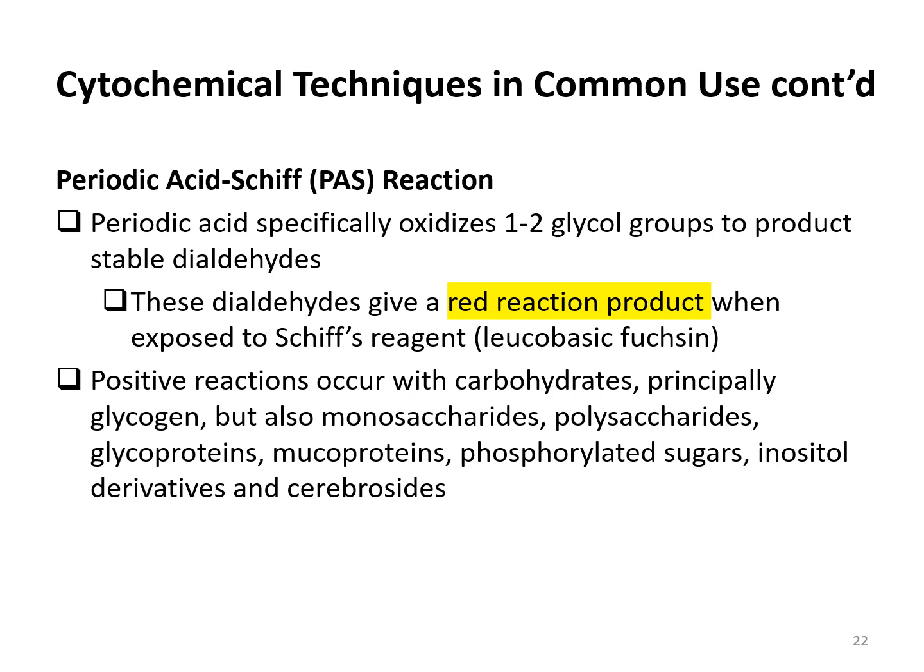Another one is the periodic acid-Schiff reaction. This reaction is particular to carbohydrate molecules. They give a red reaction when exposed to Schiff's reagent, also known as leucobasic fuchsin.